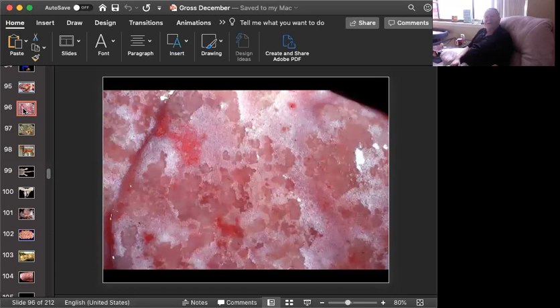Slide number 2 is tissue from a cat. Can you give me a morphologic diagnosis and a cause? Okay, time's up. Another beautiful picture. This one is very up close and personal. If you didn't get this one, don't feel too bad. But having seen this a number of times, it's a great representation of the lungs of a cat who has been infected with Aelurostrongylus abstrusus, or the cat lungworm.